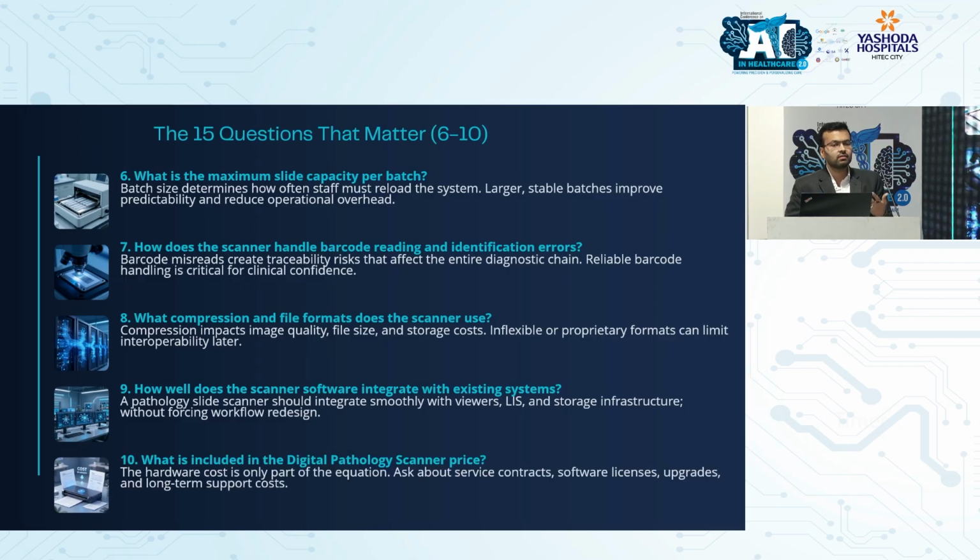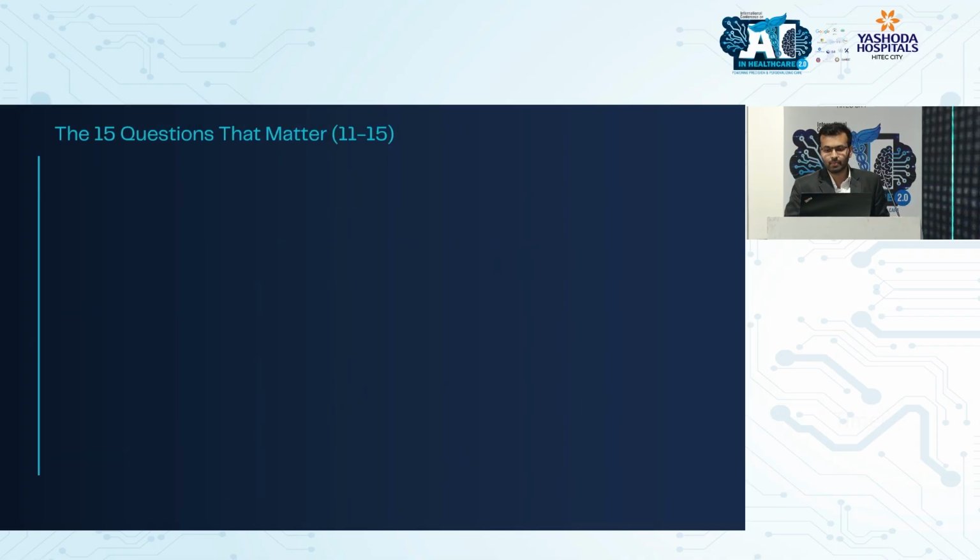What is included in the scanner price? There's also CMC, AMC, your telepathology software. All that also comes in when you're buying a scanner. It's not just like you're purchasing a camera. You need to find out everything else about it before deciding.